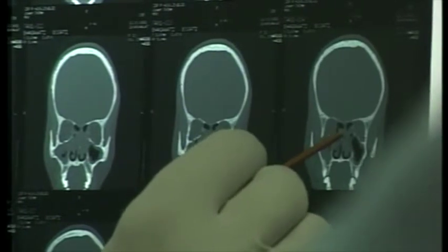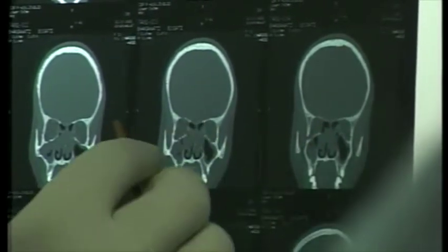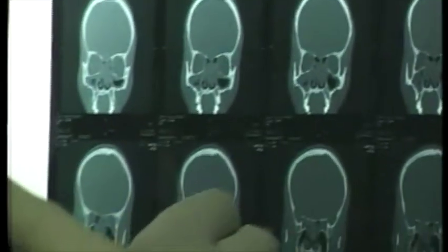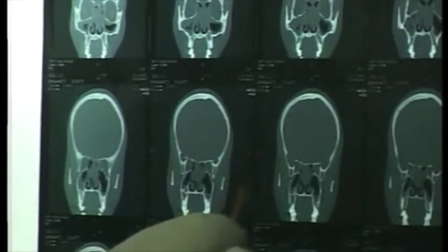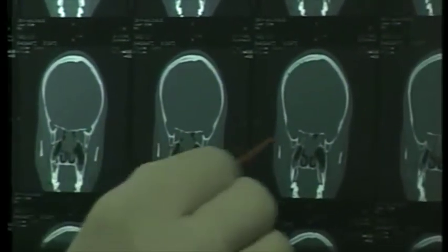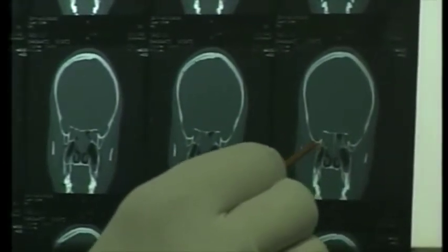All the posterior ethmoidal cells are also seen. The sphenoid sinuses are also involved on both sides. We are not very clear about the maxillary sinuses from this view.